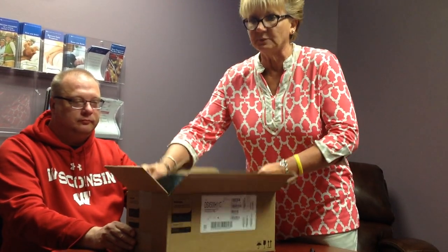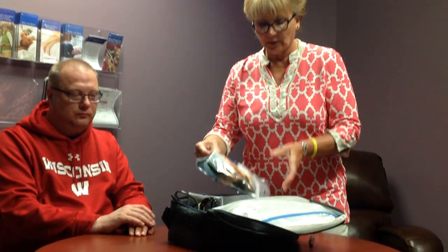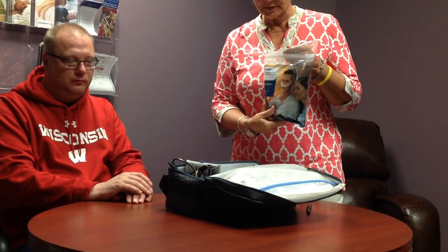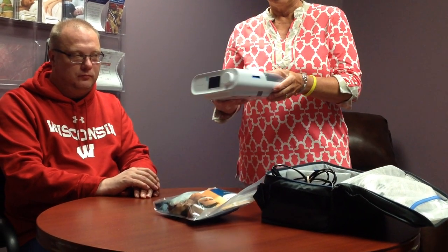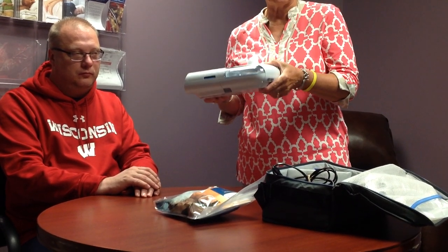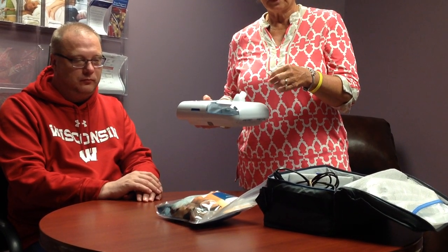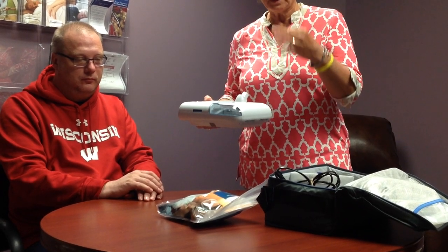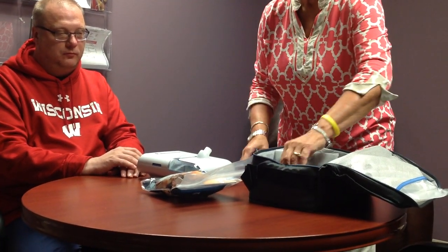You're going to be pulling out of your box. We do have set the machine already — whatever the doctor's prescription is, your machine is going to be set and ready to go. Here is the mask that we are going to take care of first. I want you to take the machine out. This is the machine; this is the humidifier portion. When we fit you with your mask, I want you to put it on with the machine so that you can see how it actually feels and make sure that you don't have any leaks.